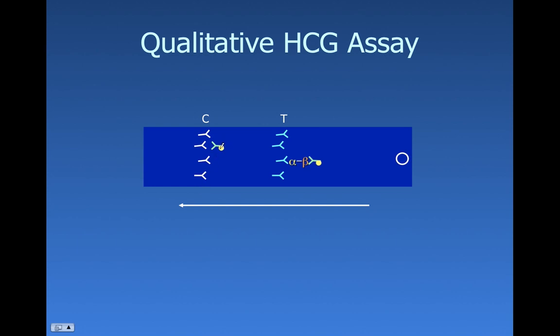If these antibodies with the beads made it all the way down to the control, then they had a chance of being caught by the test. So it makes you feel good about a negative result. You just didn't pee in the wrong place or something.